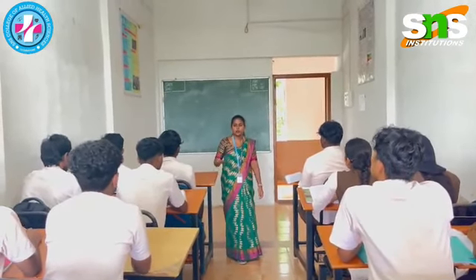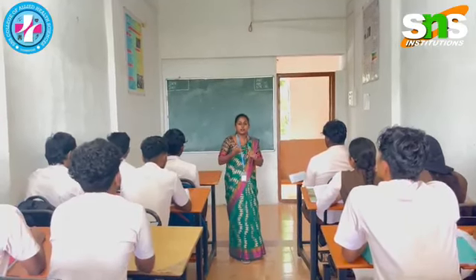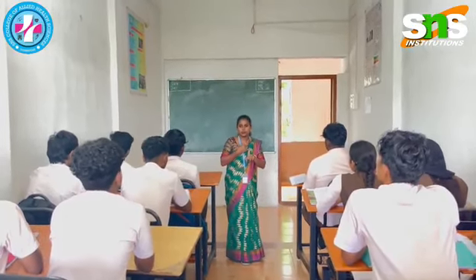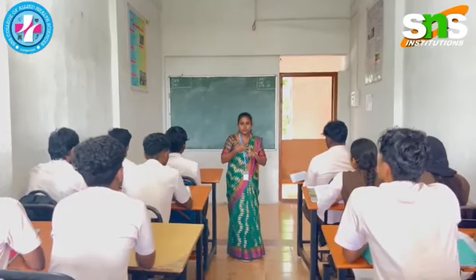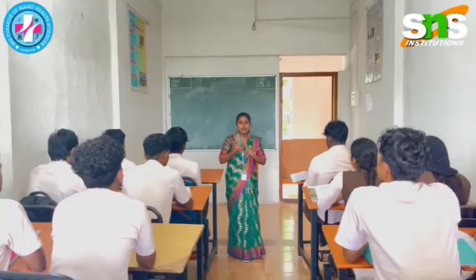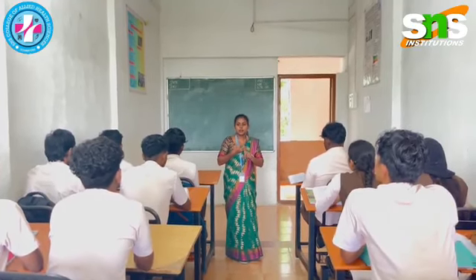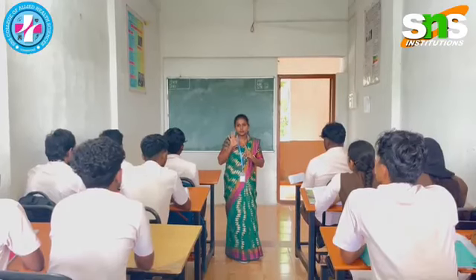We are going to take a chest X-ray for a patient. There are several views. The common view is the PA view, posterior-anterior view, and an anterior-posterior view will also be taken if the patient is having any difficulty in breathing. Next is the lateral view, which is taken to see the lateral ribs of the patient. So three major views will be taken.